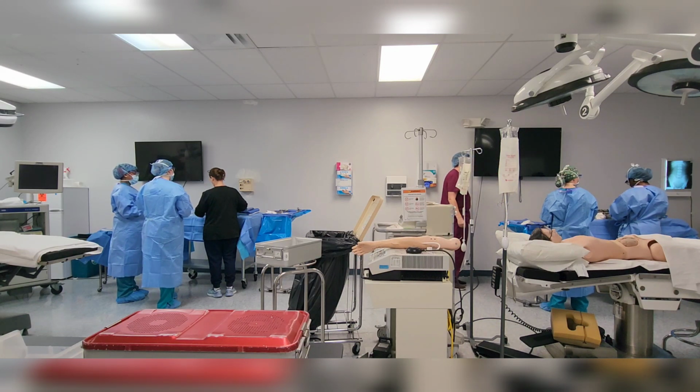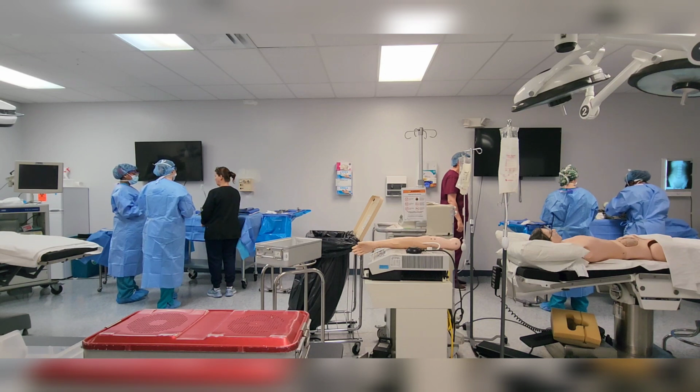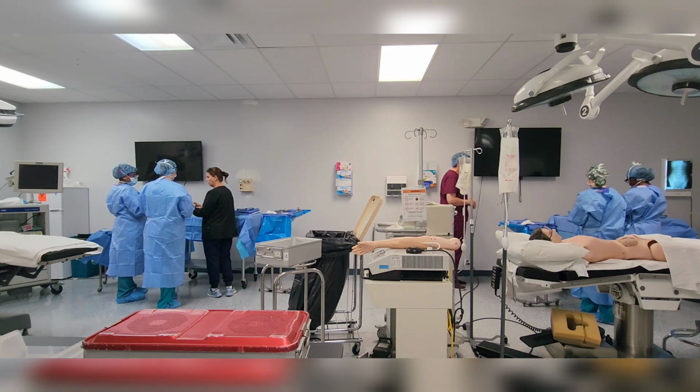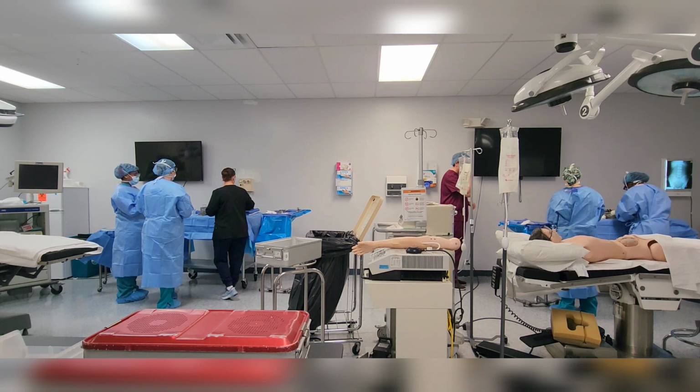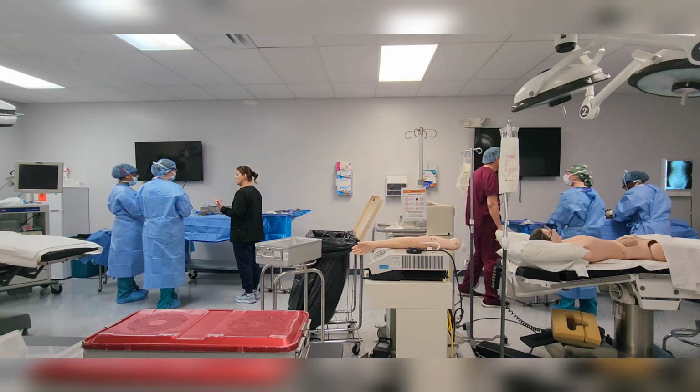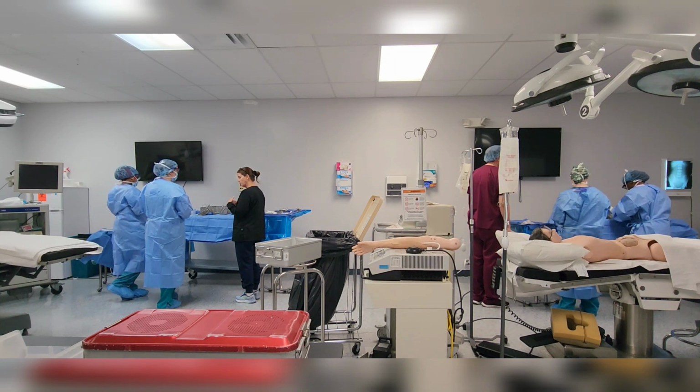So I'm not gonna do any right now. Just put a variety up here, and then maybe a couple. Army, Navies, and a couple forceps. It'll be a nice blunt dissection, but it's not going to hurt any tissues. It's just gonna kind of rub them off.